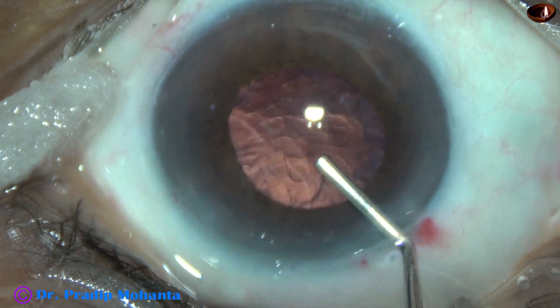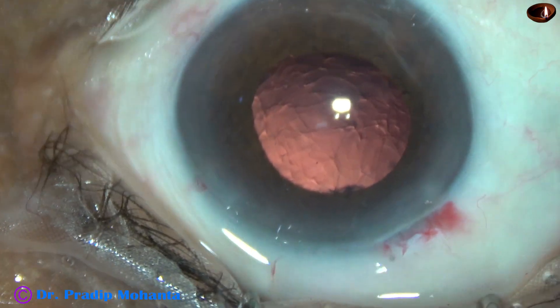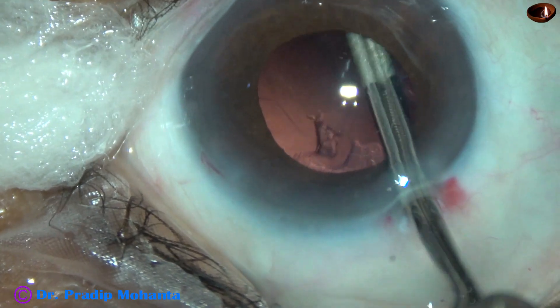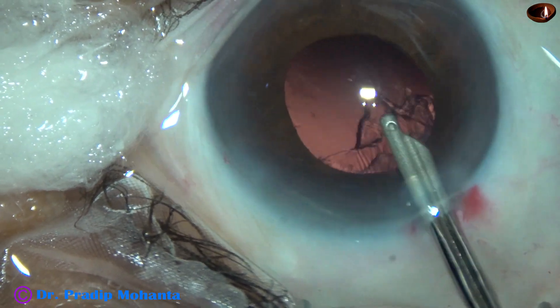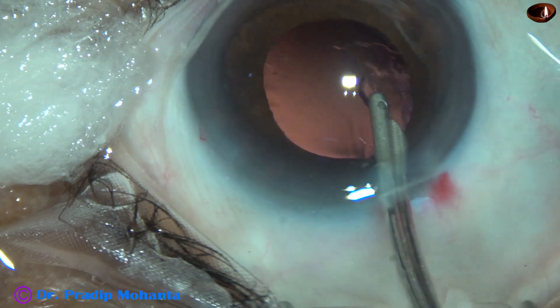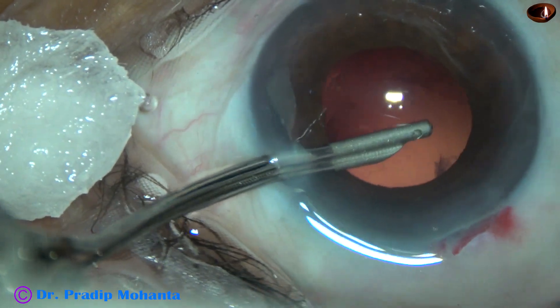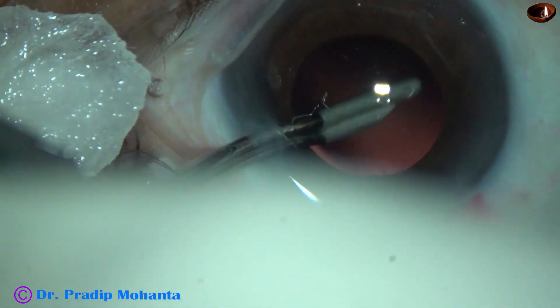Some viscoelastic is injected into the anterior chamber. Since I have done only one side port, I am going to use a Simcoe cannula 23G to remove the cortex. Through the main incision, most of the cortex can be removed. The cortex from 2 o'clock to 9 o'clock has been removed, and now the cortex from 1 o'clock and 12:30 can also be removed. A small bit of cortex at around 11 o'clock is remaining — just go once through the side port and remove this cortex. This has been a very satisfactory cleaning of the cortical matter.